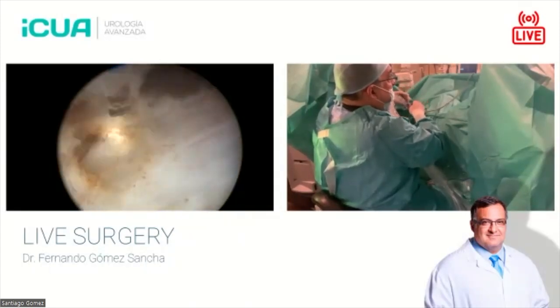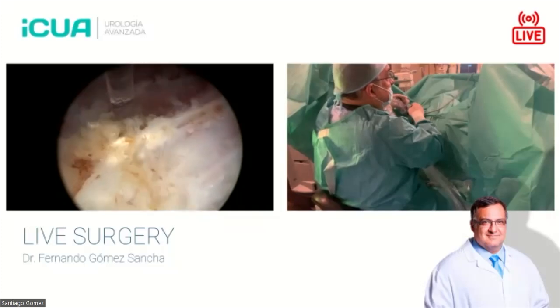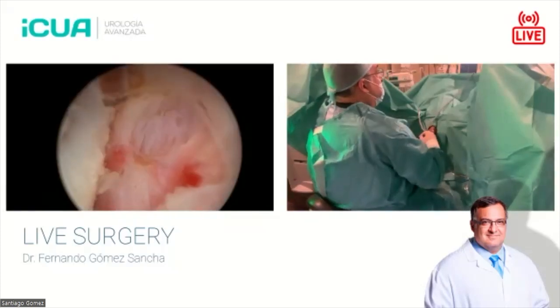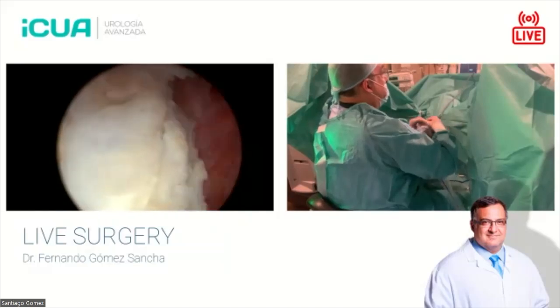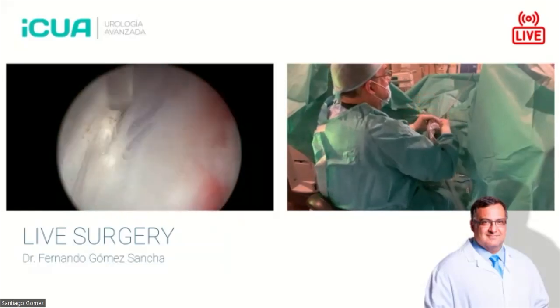And if you master the use of the energy properly, it's quite safe to do so, huh? The safe operation. Okay, so here you see I'm coming from the side. I'm reaching near the bladder neck here, I hope. Where are you? Well, there's still some way to go. So let's continue with the lateral and posterior dissection.